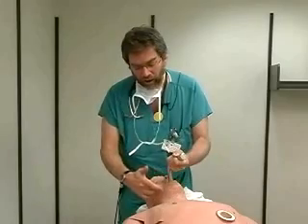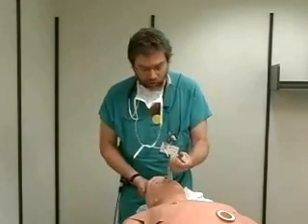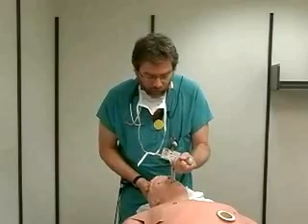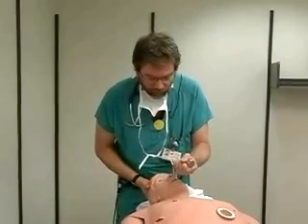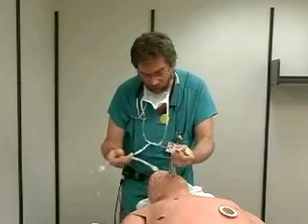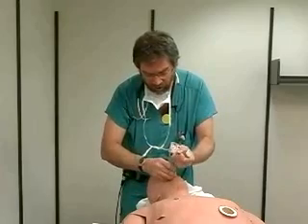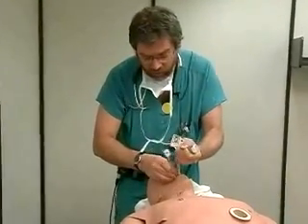This achieves a direct line of visualization to the cords. I visualize the epiglottis with the Miller blade, pick up the tip, visualize the cords, bring the tube in from the side, and intubate the patient.